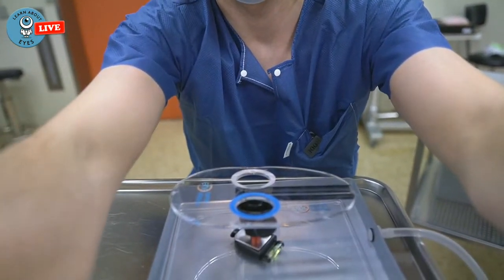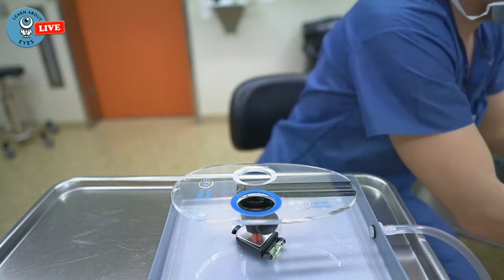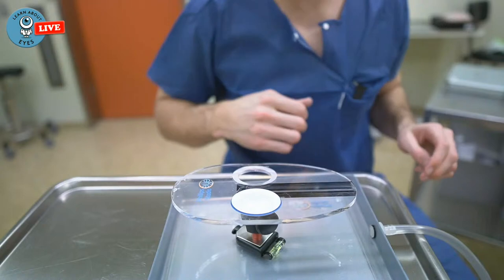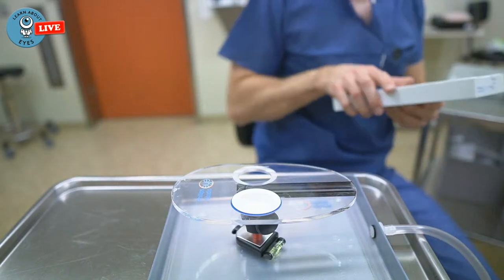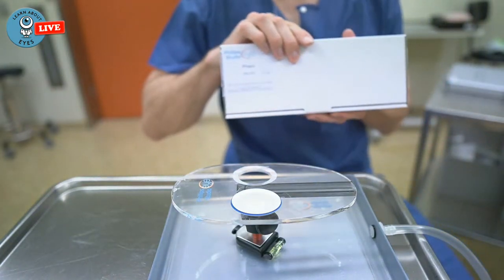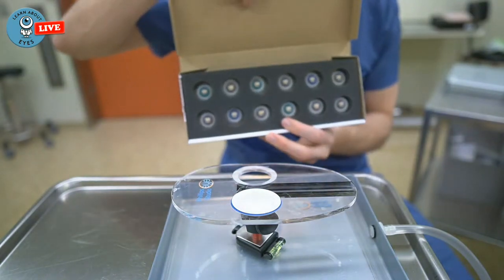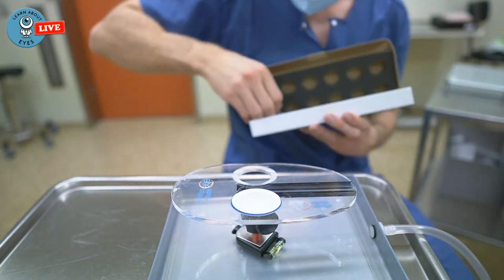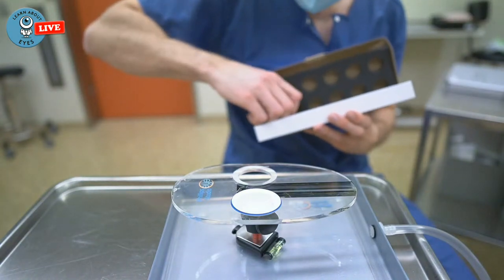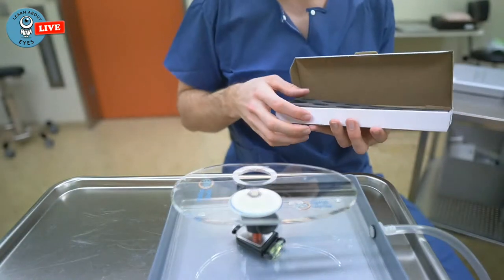Right, and then let's show you how we put this in here. We need one of these eye cups and an eye. So I think we're going to use a normal phaco eye for this one first. These are just eyes with a pretty hard cataract, but they're fun. They're kind of waxy. The feel of the lenses is not actually all that great. They don't feel as real.